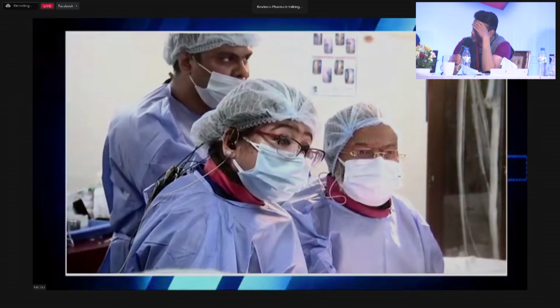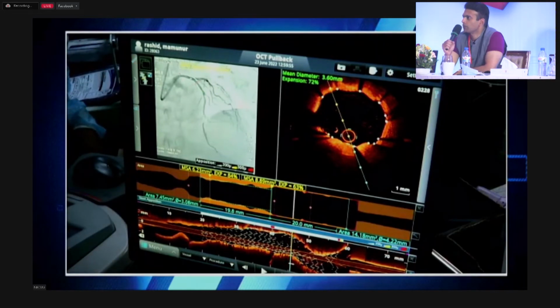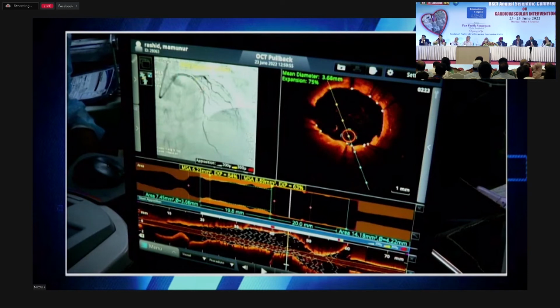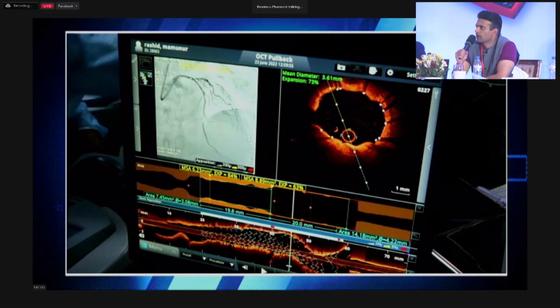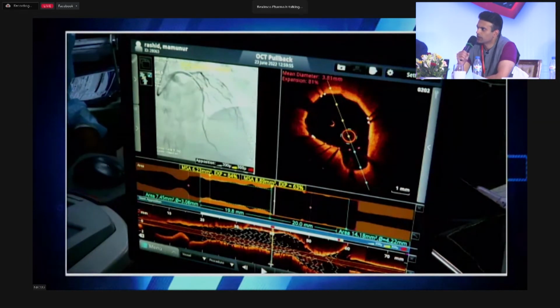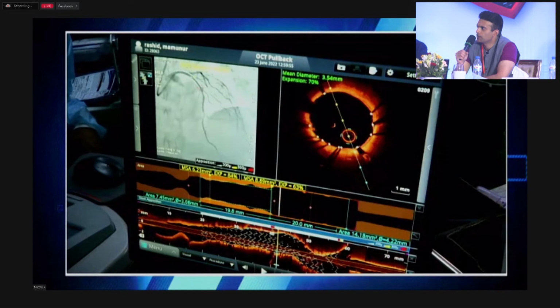Can you put the OCT back, please? Sure. Okay, come proximally, please. I think it was proximal anyway. We just scan back and forth there slowly. Okay, keep coming. No. So let's pick one direction and we'll go all the way in that direction till we find what we're looking for. So go distally and don't go backwards, just go distally. Keep going. Fine, this is okay. So let's come back proximally now. Keep going. Go proximally. Come proximally, keep going.